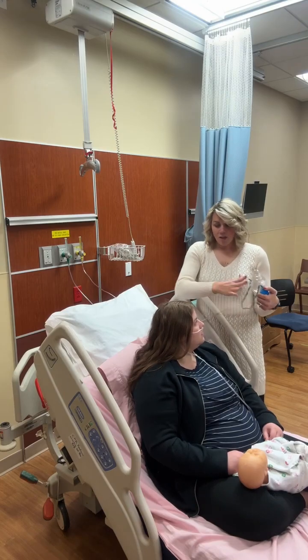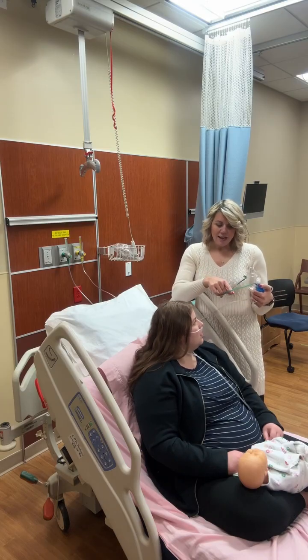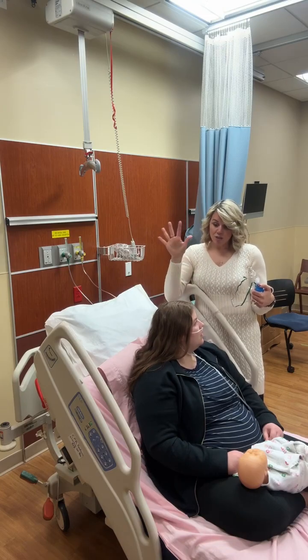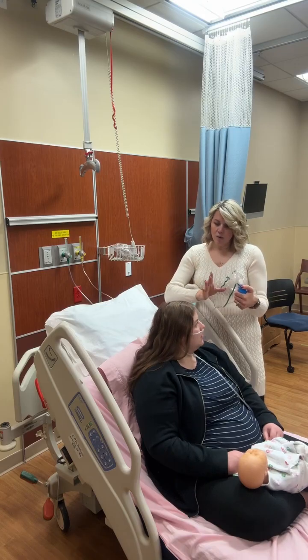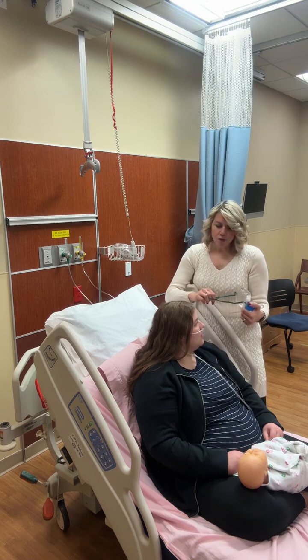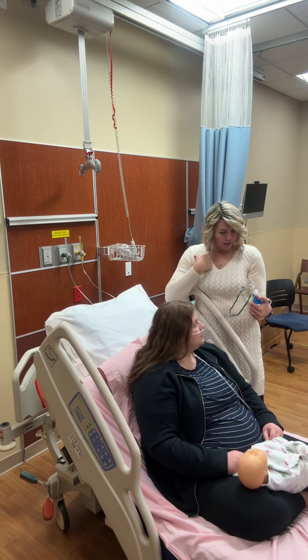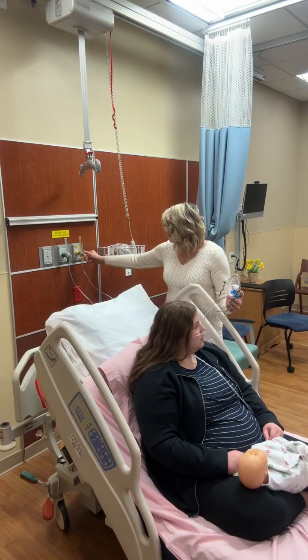This mask is going to go over your face, and this is going to go behind your head. It's going to stay on your face for about 10 to 15 minutes. If you start feeling anxious or anything like that, just let me know, and we can adjust how we're doing this. I may be able to just hold it here by your face for you if it gets to be too much. Okay. Do you have any questions? Nope. Okay. So I'm going to turn it on to 8, which is great first, because that's the perfect flow rate.